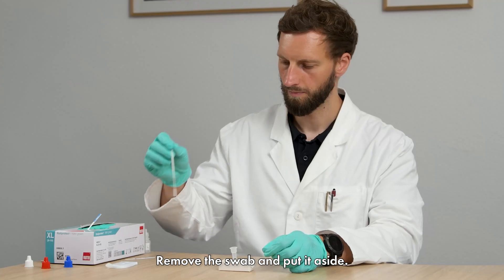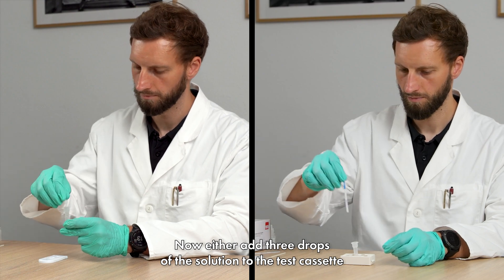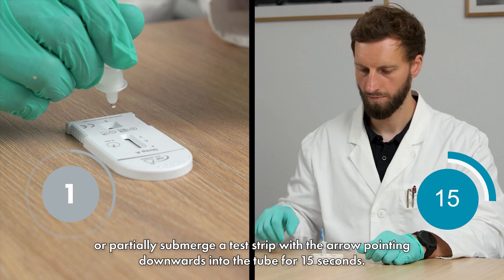Remove the swab and put it aside. Now either add 3 drops of the solution to the test cassette, or partially submerge a test strip with the arrow pointing downwards into the tube for 15 seconds.